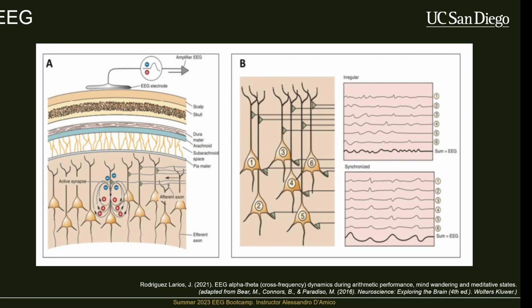One of my favorite things is this beauty that we can even record anything by just putting electrodes on somebody's scalp. And tremendously, we can record a lot of very relevant information with that. It's not just like we're recording nonsense and noise. We've identified things that are very consistently elicited across thousands of people, tens of thousands of people. And I wanted to point out that all of these layers of protective material are sort of acting as a low pass filter.